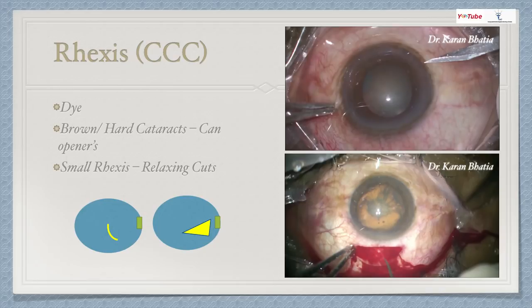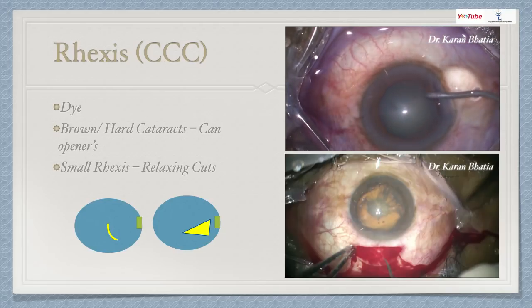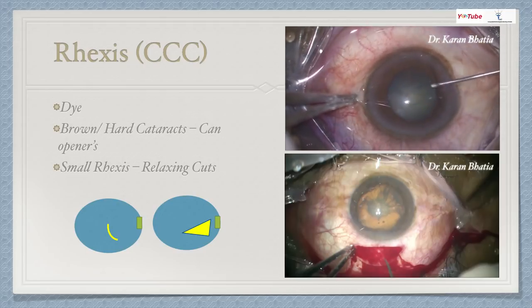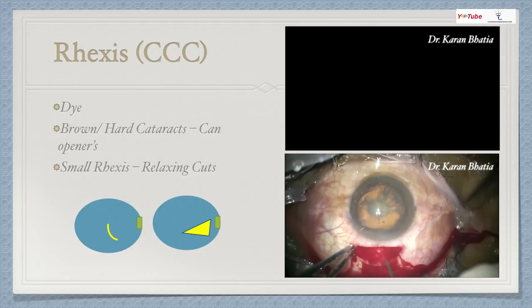A modification: we generally do capsulorrhexis via the side port. I recommend making the initial cut in a C-shaped fashion towards 12 o'clock or 11 o'clock, then raising the flap and continuing the capsulorrhexis. This is advantageous because if extending from center towards 5 or 6 o'clock and raising the flap, the bigger part of the flap comes out towards the side port. In the first video, I am making a side port entry, injecting ample viscoelastic, making a C-shaped cut, then using shearing force to complete a good capsulorrhexis.